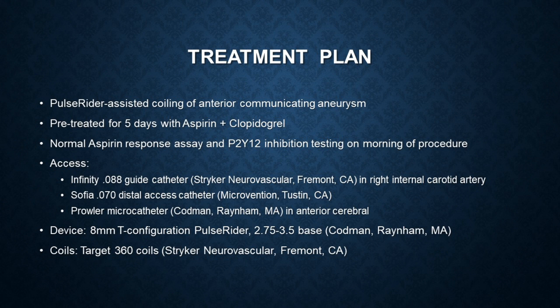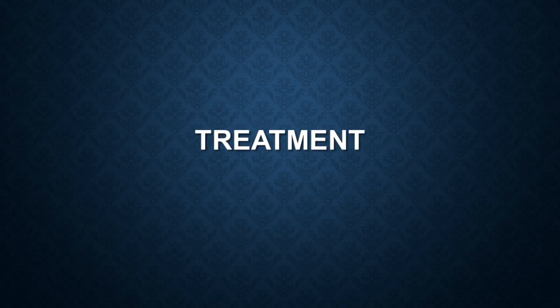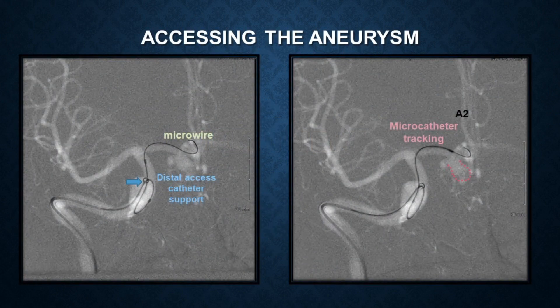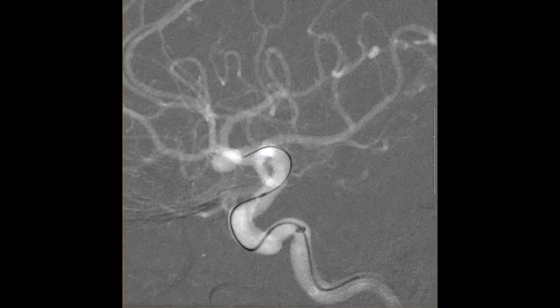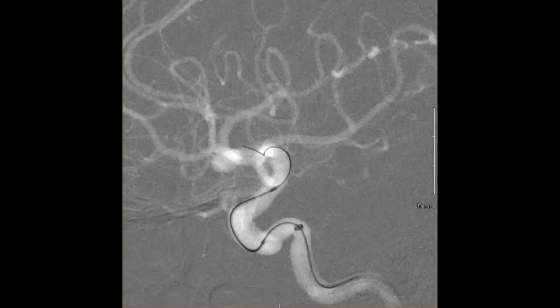The access system included an infinity guide catheter, a distal access catheter, and a Prowler Select Plus 021 microcatheter. Based on her measurements, an 8 millimeter T-shaped Pulse Rider was chosen. The A2 was accessed with a microwire to allow deployment of the device at the level of the ACOM. To enhance trackability and support for the microcatheter, the distal access catheter was positioned in the cavernous ICA.